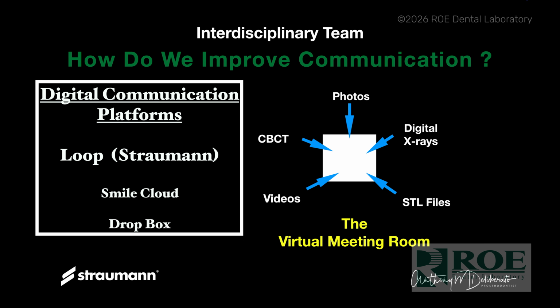And to me, videos are very important because with static photos, sometimes it's hard to really get that perfect shot, that shot of the transition line. And with videos, we can have the patient be a little more natural. We can crack jokes and make them smile bigger. So to me, the videos are a very important part of the workup.